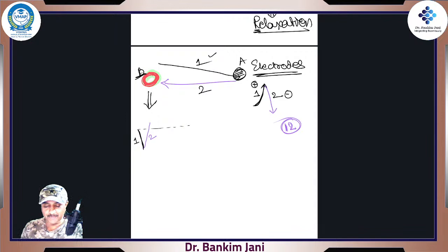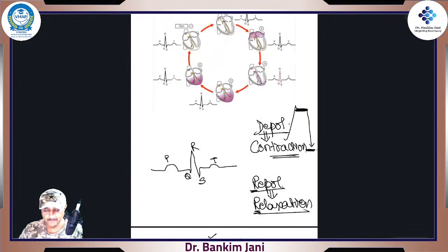Now we'll be adding what is depolarization and repolarization with a standard pattern. Because when you see aVR, just remember there is a lead called aVR, the augmented VR lead. In this, you'll find everything is reversed, right? The one which is coming towards the electrode will show positive, and the opposite. Let's not confuse aVR right now, but you'll automatically see. So this is one. Now let's add something to this. Here it is. This is what we are watching, a very standard pattern, right?